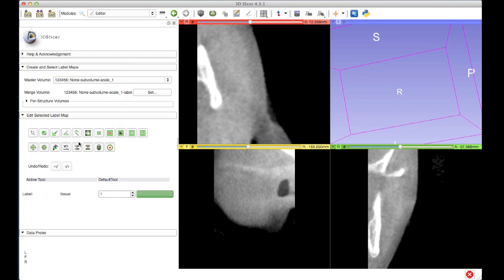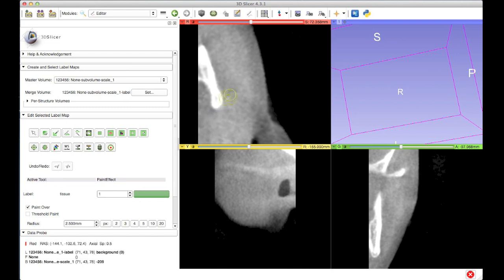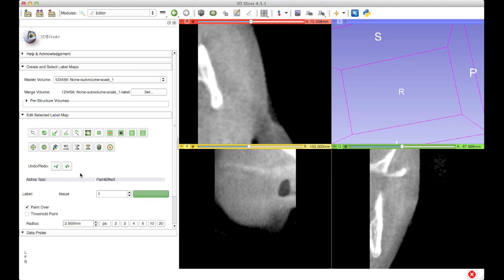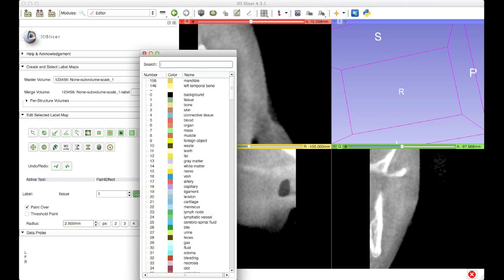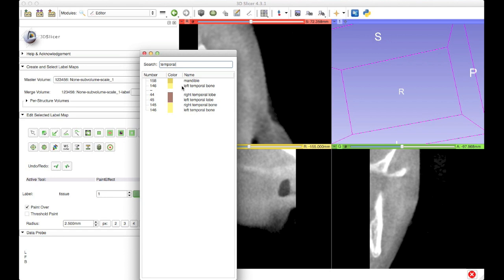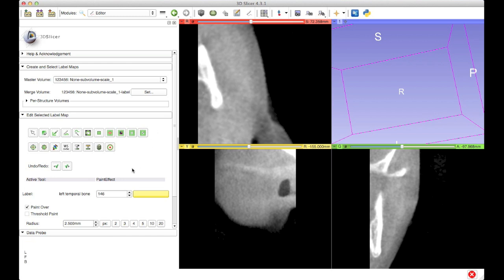In the editor module there are a range of tools you can use to manipulate this label map — they go from simple paint brushing techniques, where I can highlight the paint brush and paint directly onto my image, all the way to automated segmenters, thresholding techniques, and so on. I'm going to use the undo button to get rid of the blob I created, and I'll begin by choosing the appropriate label value. I'll click on this color swatch here which loads the full list of available labels. I know there is one specific to the temporal bone, so I'm going to search for that — left temporal bone, number 146. So now I've selected the appropriate label for the bone segmentation.